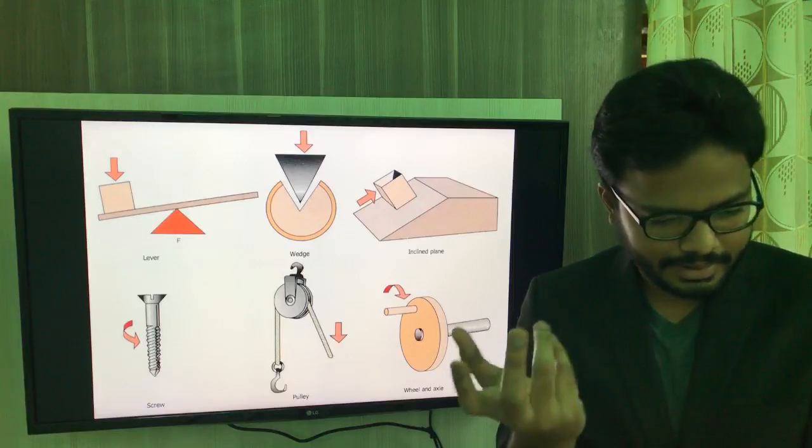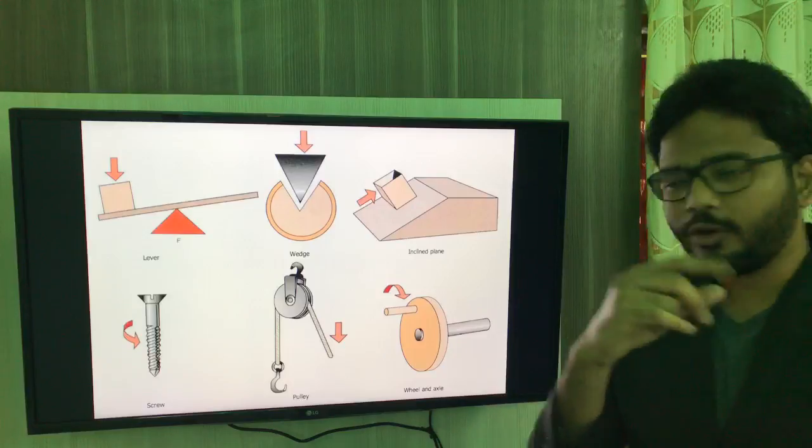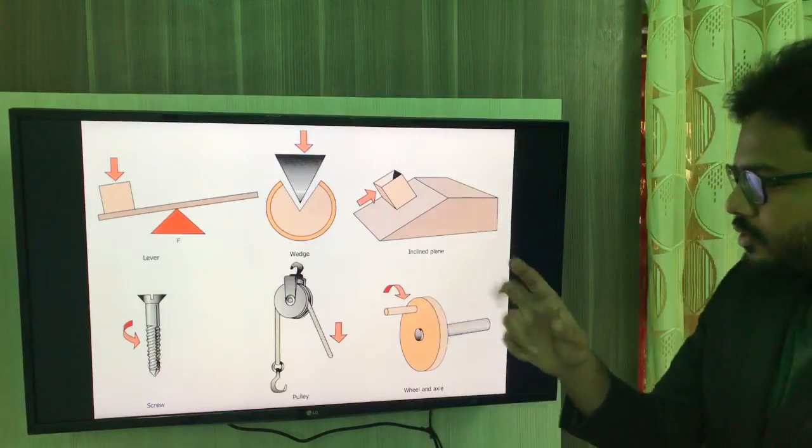Good. It can be plating, very good. Implant, reduction of fractures, and also placement of pins. You have this complex amalgam pin placement. Good, isn't it? So, screwing.